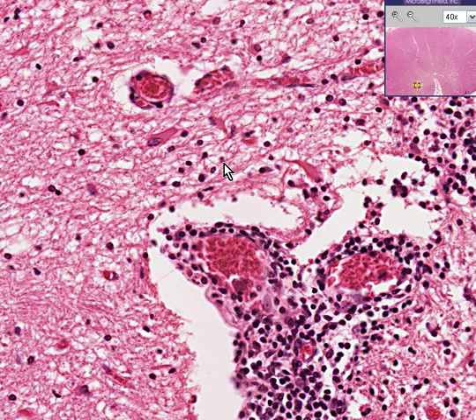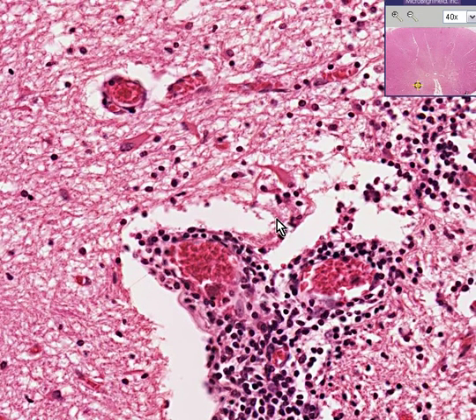These anterior horn cells — the motor neuron cells controlling the muscle we just saw — are being destroyed. They are being destroyed by an inflammatory process. The chief and most common inflammatory process involving motor neurons of the anterior or ventral horns is the polio virus.